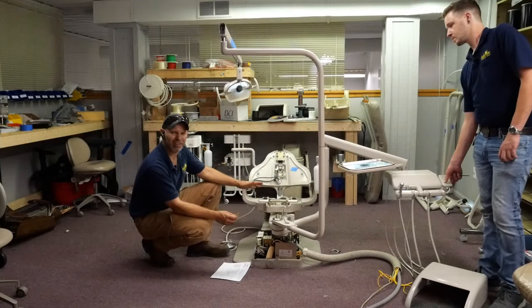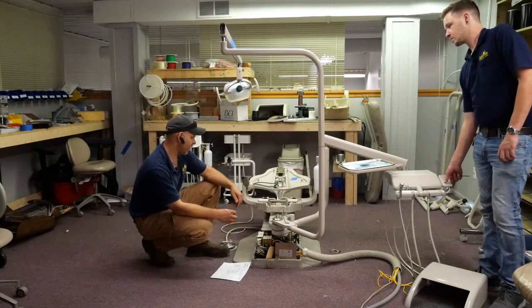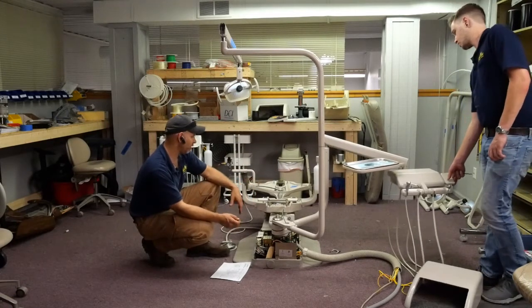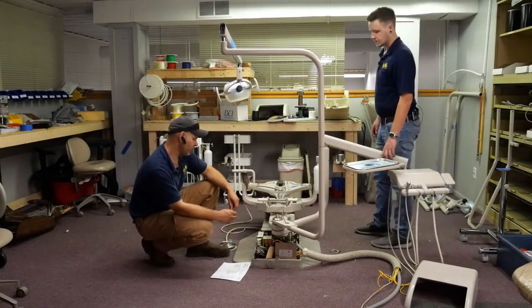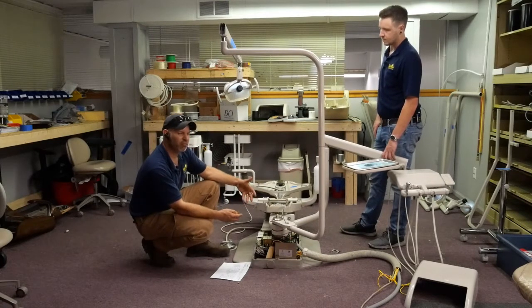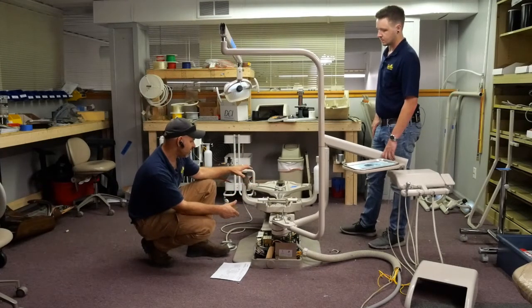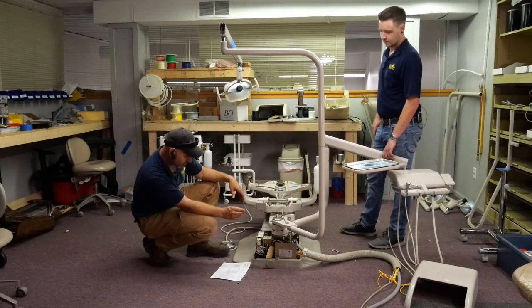Now this might be a little bit outside the scope of what a dental staff member might do, but this is still good information if you're curious how you would go about checking and filling your hydraulic fluid. There are lines on the side of these hydraulic reservoirs, which is where all the hydraulic fluid is stored, but it's kind of hard sometimes to read those lines with regard to how much fluid is inside the reservoir. So with the cylinders completely compressed, all the oil is back in the reservoir.